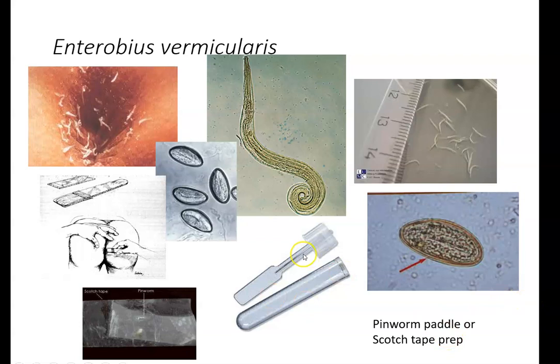But yeah, I've only done one pinworm paddle in all my life. I can't tell you how many Scotch tape preps. But one pinworm paddle. It was super nice to be able to use because you could just use the paddle as a slide. You just pull it out of the cap and set it on the microscope and look at the slide. But Scotch tape prep works just as easily. It doesn't matter; the best is to have the clear Scotch tape, but this translucent stuff works too.